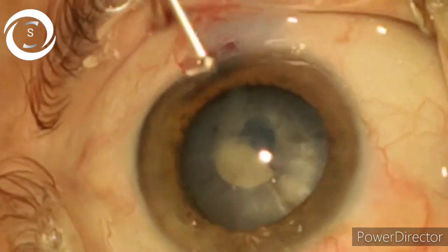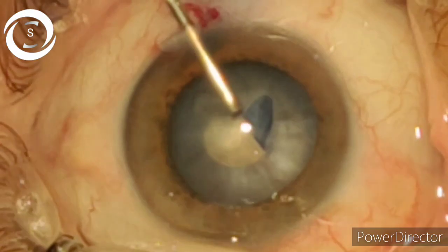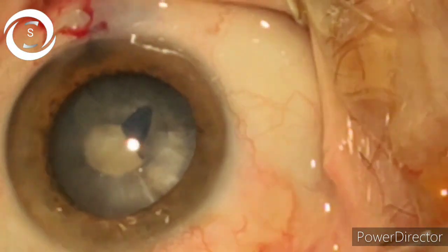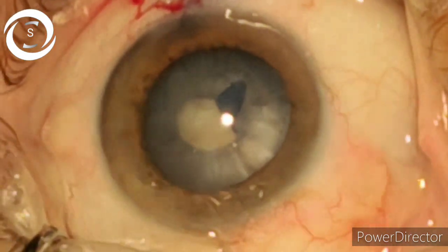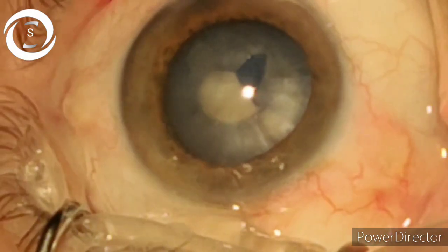Now gently puncture the anterior capsule in the center. You can see that as soon as I gave a nick in the capsule, due to the raised intracapsular pressure, the cortical matter came out of the capsule. Now here, don't extend the rhexis manually — move out of the anterior chamber.